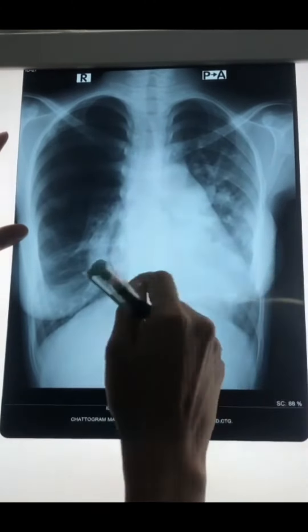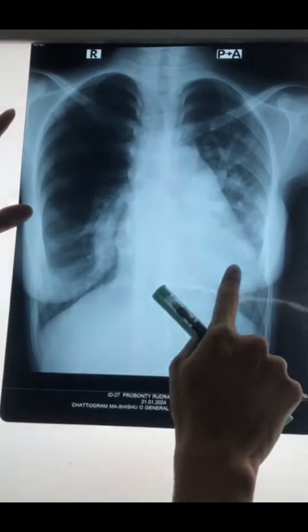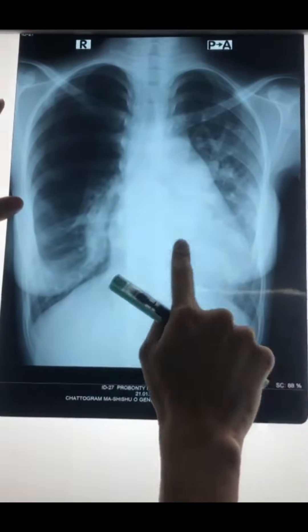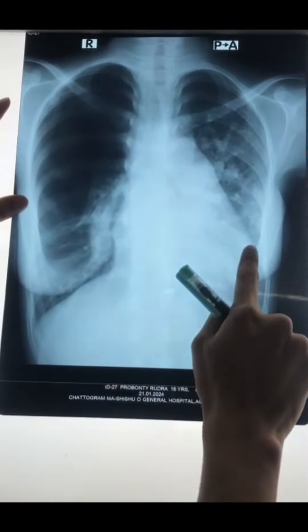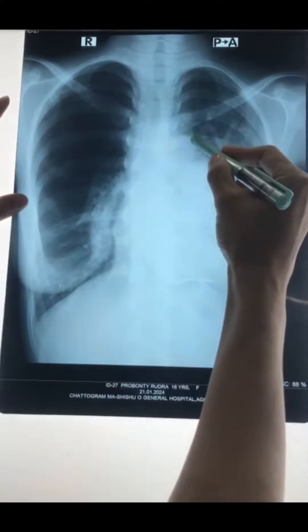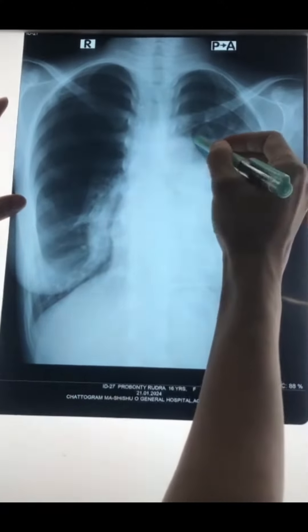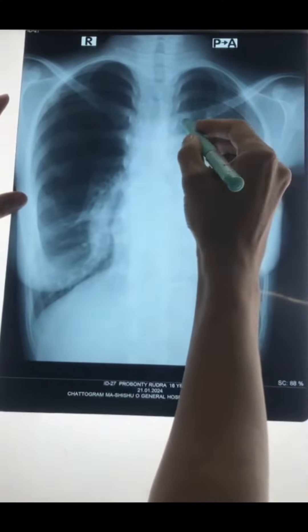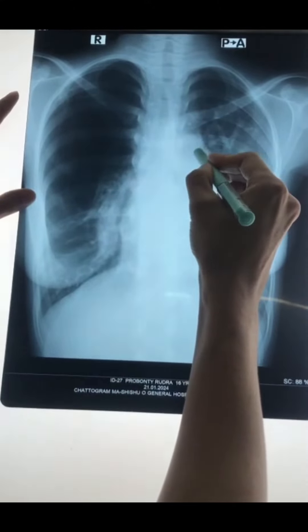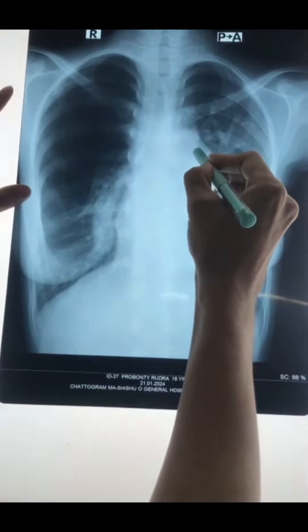Here is an important finding. Here is the transverse diameter of the heart. In this case, this is cardiomegaly. This is the left heart border, which shows the aortic knuckle and convexity, which is called the pulmonary conus.